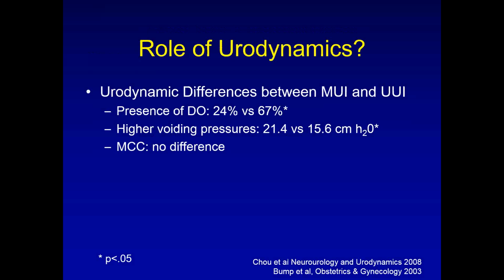So how does urodynamics help you if you go through this? Well, unfortunately, there are no clear-cut findings that are going to steer you into making things clear. It's part of your whole presentation. Will you see specific urodynamic differences? If you had a patient with mixed incontinence versus urgent incontinence, you'd be more likely to see the true overactivity. But just because you don't see the overactivity doesn't mean they don't have it. That's my point there. If they have mixed incontinence, they're more likely to have a little higher voiding pressure.